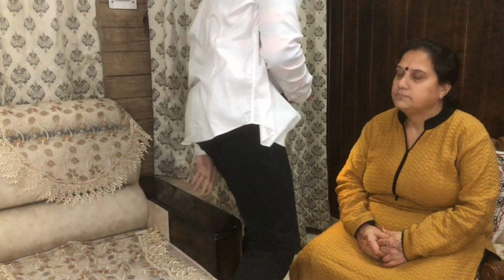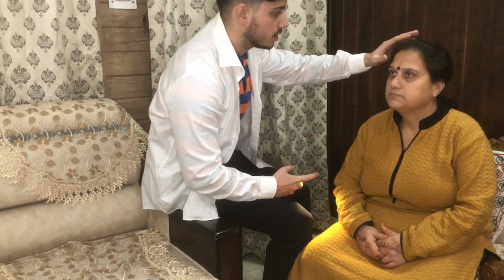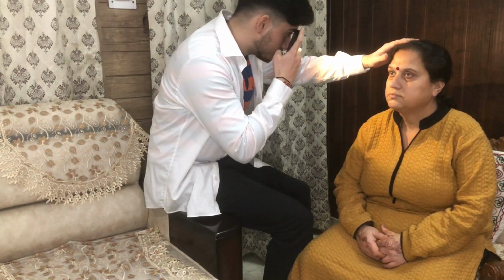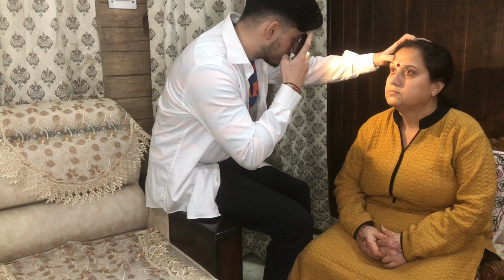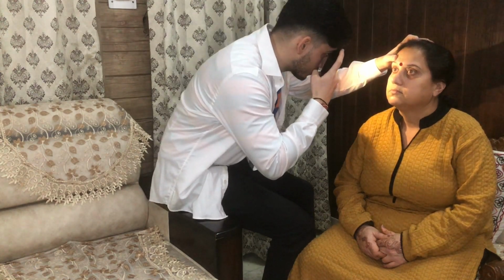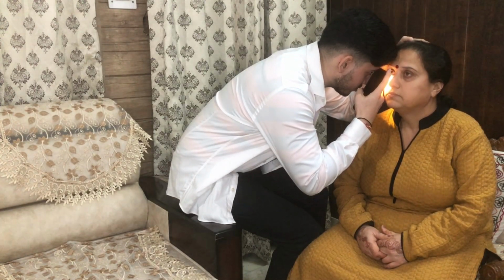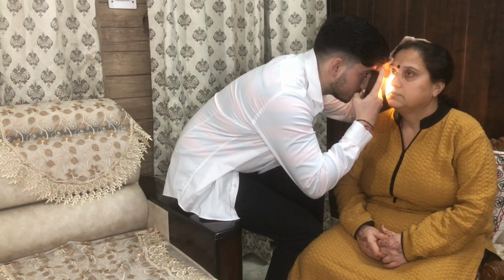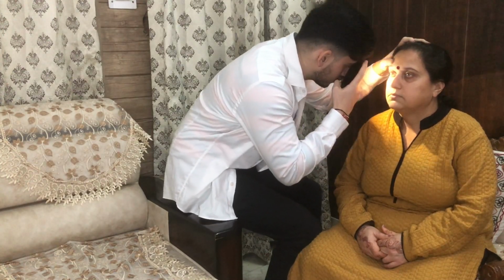For fundoscopy examination, get a fundoscope, and for examining the right eye of the patient, hold the fundoscope in your right hand, stand on the right side of the patient and use your right eye. Ask the patient to look straight towards the wall or through your shoulder, and you yourself hold the fundoscope 10 to 15 degrees laterally from the line of vision. And after observing the red reflex, get close to the patient until you can see the inner structure of the eye. Now look for superior nasal, inferior nasal, then inferior temporal and superior temporal structures.